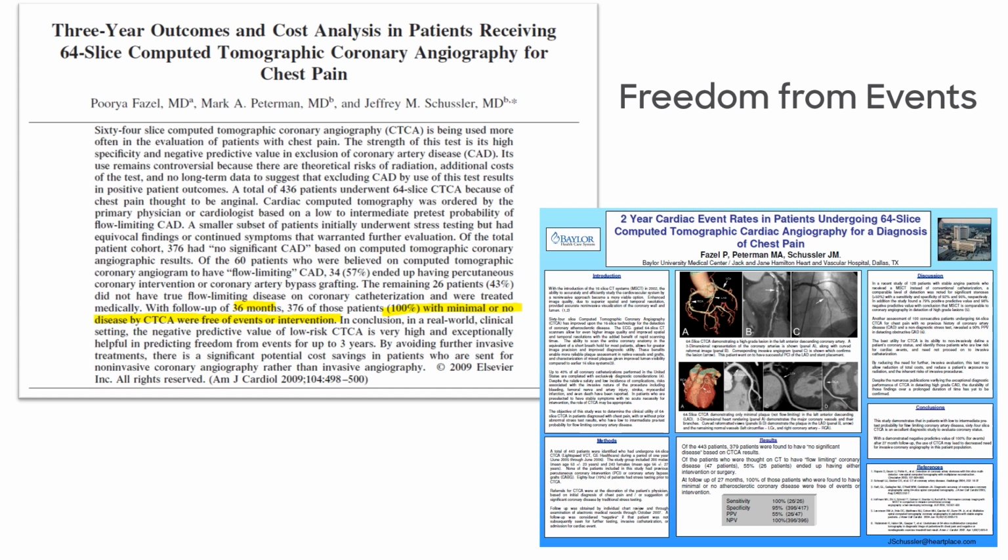And it makes sense. If you don't have any coronary disease, you really can't have a heart attack. You've got to have some plaque. And this bore out in several other studies, 5 years, 7 years. So if you have a completely normal study, you're probably good for at least a little while.